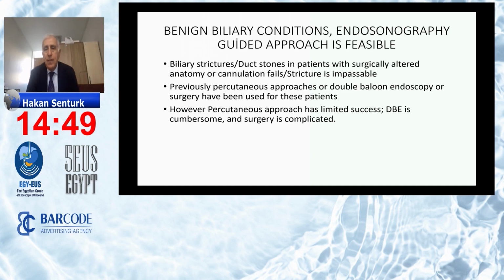Percutaneous approach has limited success, and double balloon endoscopy is a cumbersome technique, and it may fail in many of these conditions. And surgery is very costly as well as complicated. So we think that in benign biliary conditions, endosonography guided approach is a feasible option.